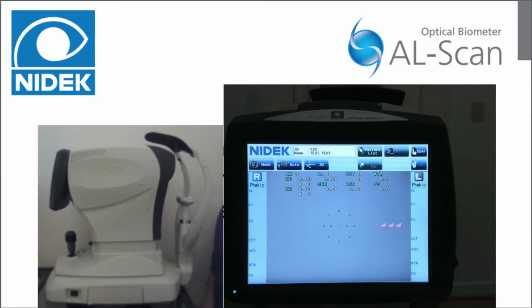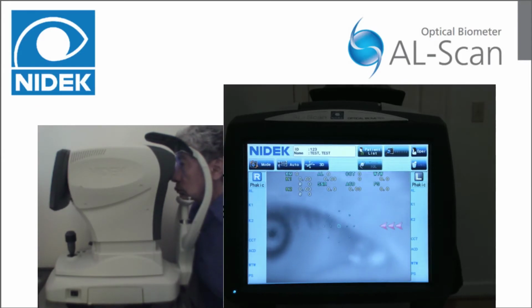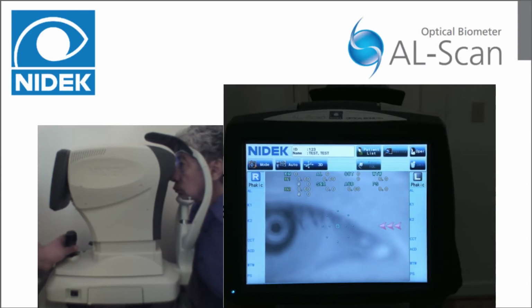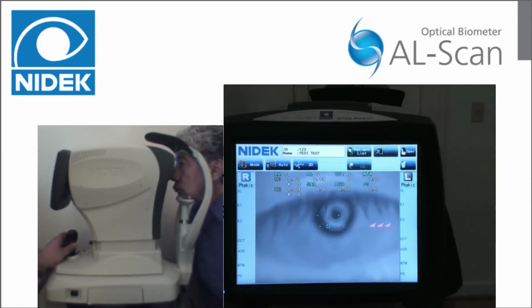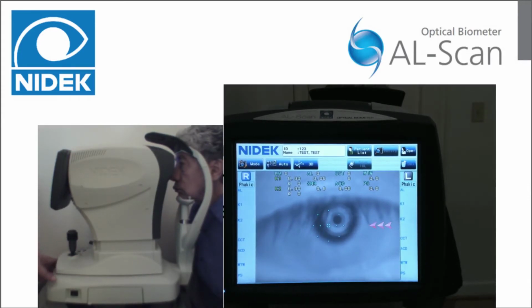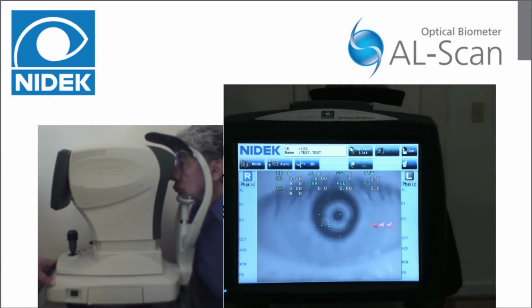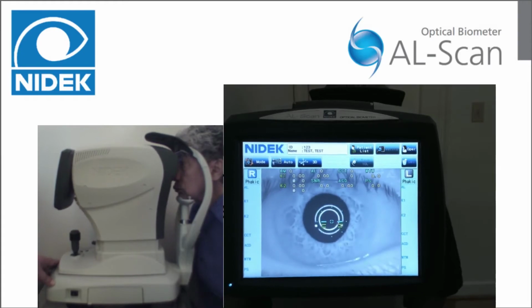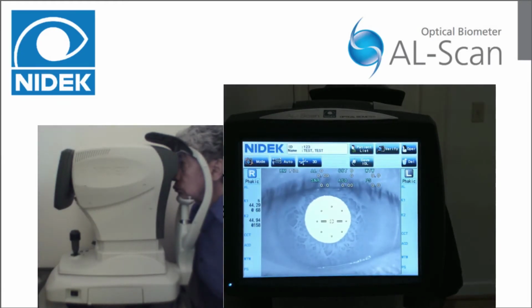Prepare the patient for measurement. Clean chin and forehead rests that may contact the patient. Have the patient put their chin on the chin rest as deeply as possible and their forehead lightly against the rest. Adjust the table height and chin rest height to allow for comfortable position for the patient's neck. Ensure the eye of the patient is aligned to the mark on the forehead rest. Instruct the patient to blink several times, then look straight ahead at the red dot and hold eyes wide open.